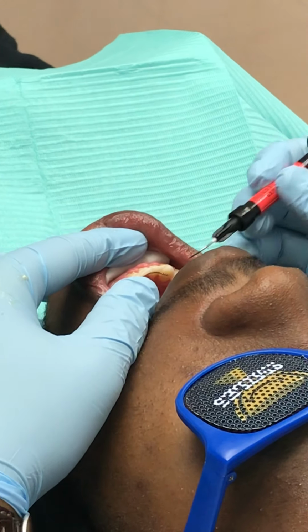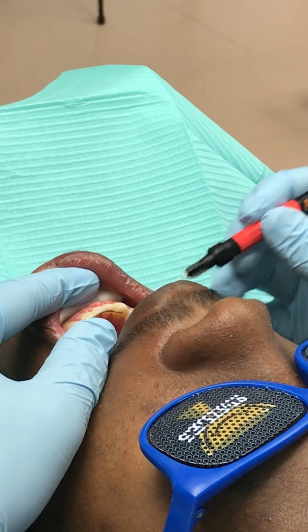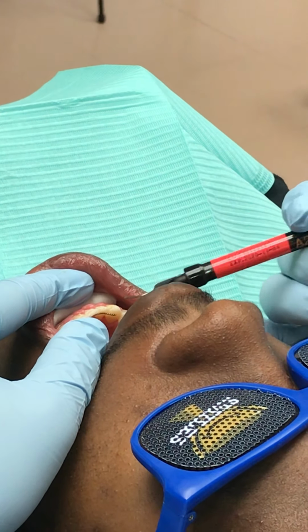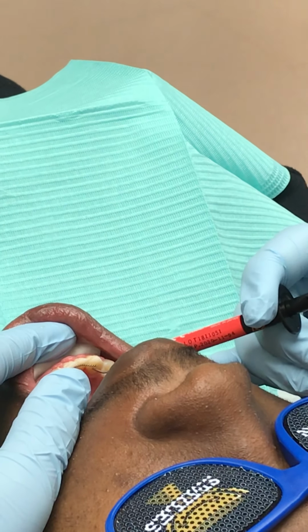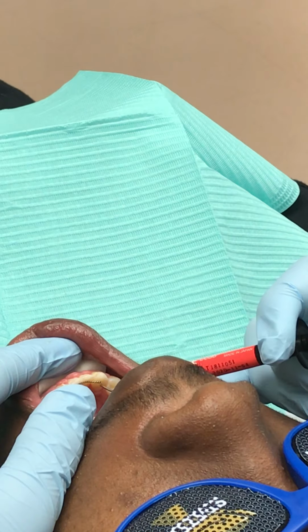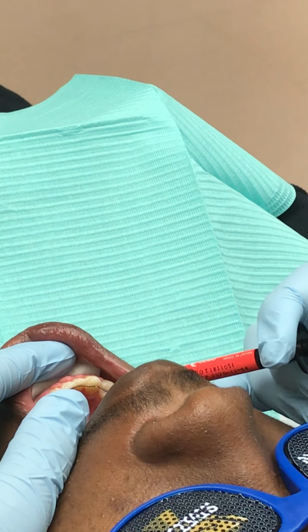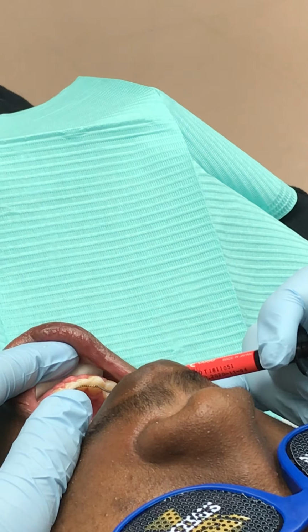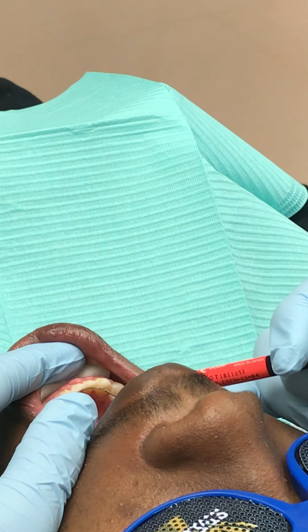So the lower left canine is set. So now it just required a little adjustment there. I just positioned, open wide for everybody, I just positioned that wire so it was laying flush with the surface of the enamel. And now we're going to go back and we're going to use the same process. We're going to start gingival to the wire, then we're going to go up and around so that we're incisal to the wire. And then we're going to come back and go right over the wire.